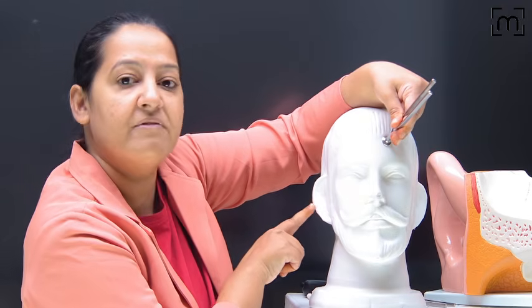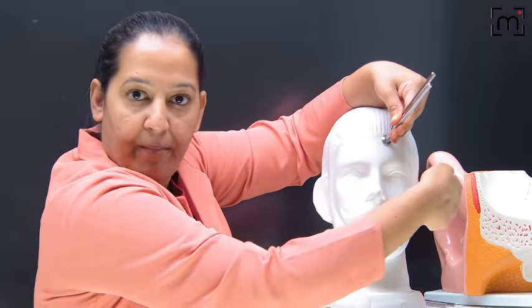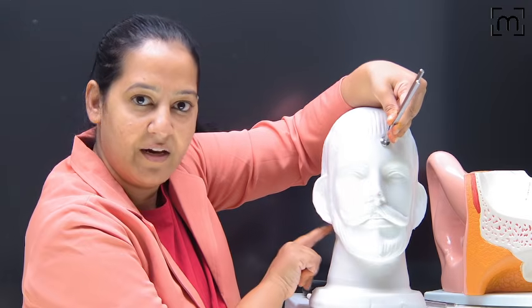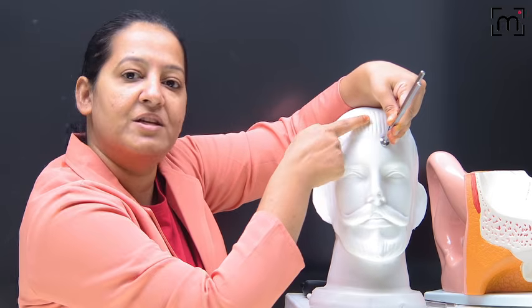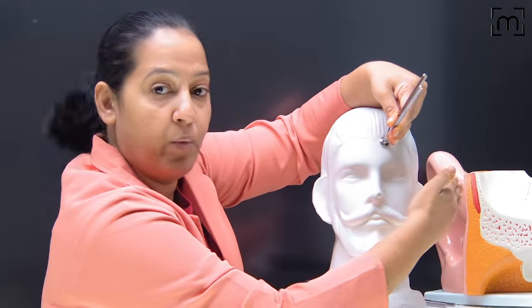Suppose 50% of the cochlea is damaged, so only 50% of the waves are going from here, but from here, 100% of the waves are going. After reaching the mastoid, here 50% is activated, and here 100%, because 50% is damaged. So here 50% interpretation is going and here 100%. So it is lateralized towards the better ear.